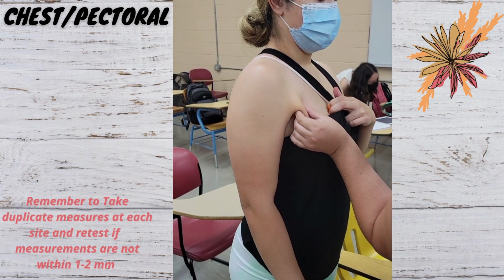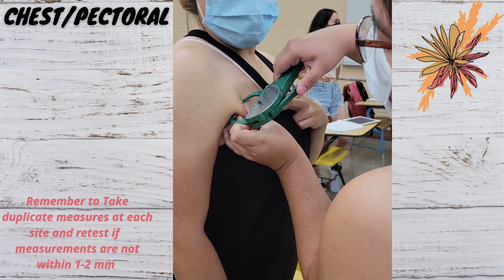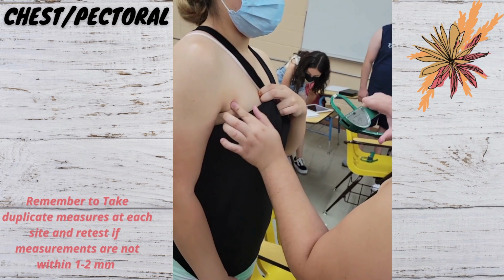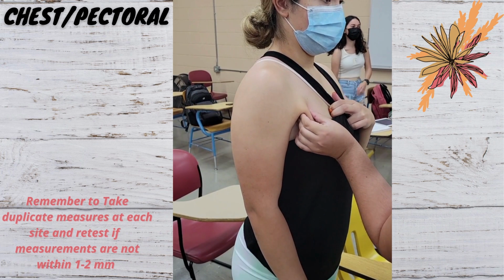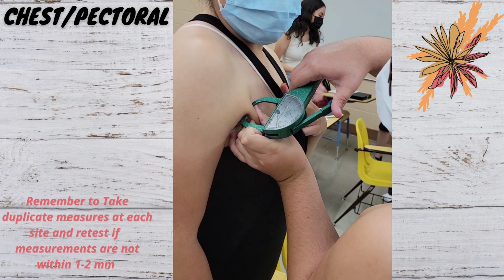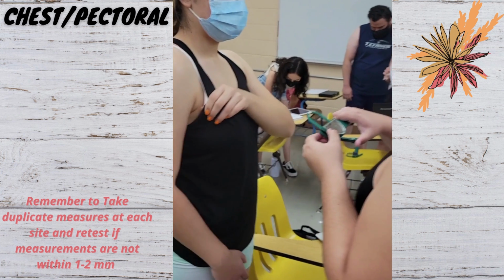When taking the right side chest or pectoral measurement, for men you're going to get a diagonal pinch halfway between the armpit and the nipple. For women, you're also going to get a diagonal pinch, but one third of the way between the armpit and the nipple. Use the skinfold calipers and pinch the diagonal fold, hold for 1 to 2 seconds, then record the measurement.